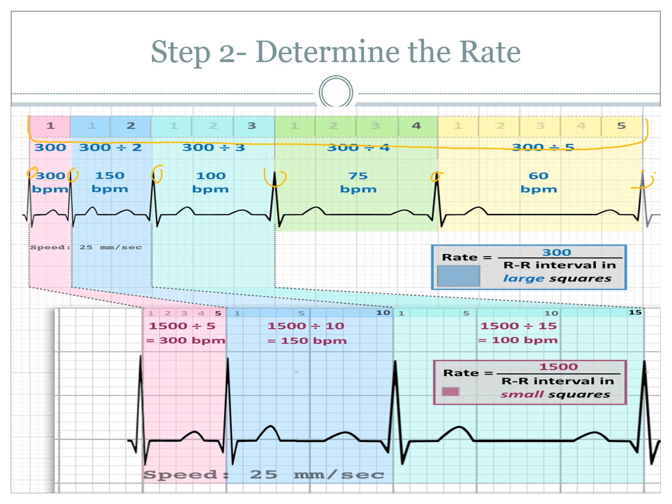If there is no association between ventricle and atrium, then you can get an atrial rate and a ventricular rate. But what you should always get is a pulse rate as well, because remember, this does not tell you cardiac output. This just tells you how much cardiac activity you have captured on a sheet of paper. That's it.